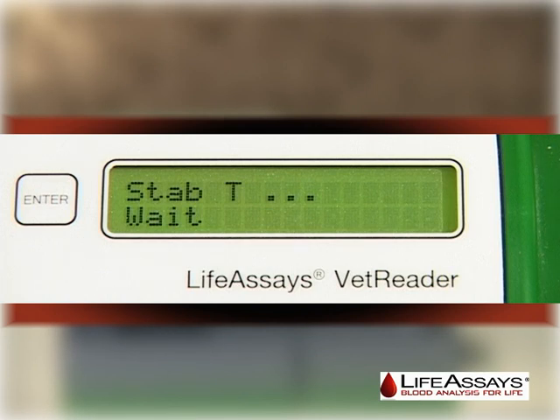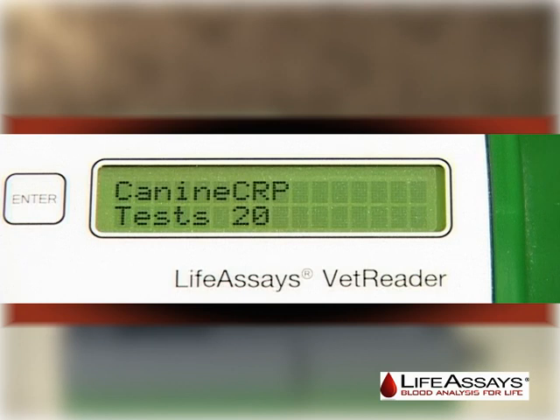Once stabilization is complete, the instrument is ready for use and will display K9 CRP test 20, where 20 indicates the number of measurements left on the chip and K9 CRP test indicates the Life Assays reagent kit name.